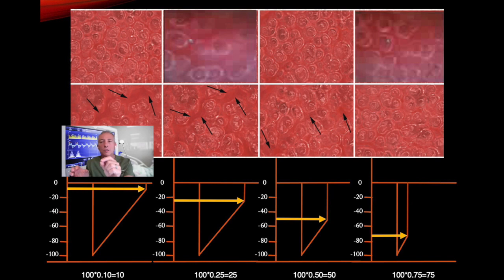If it goes back to the baseline, the T-low is too long. I'm allowing, again, the exhalation of gas to be so long. And the purpose of APRV is to actually just take advantage of the prolonged inspiratory time, but I'm not going to allow you to de-recruit. So I need to shorten that so I can start generating air trapping.